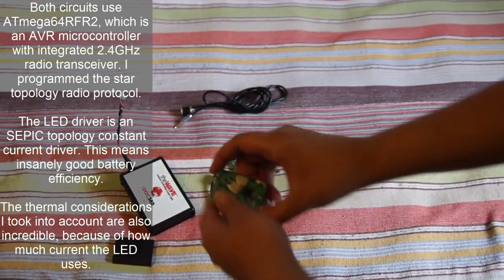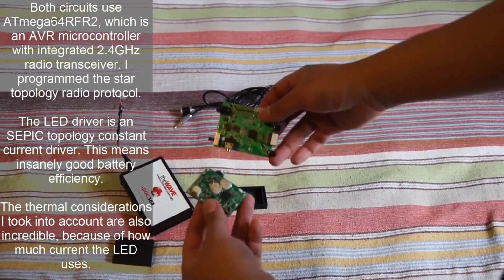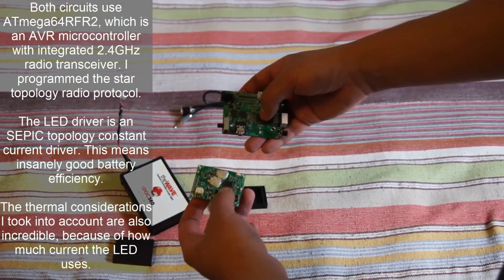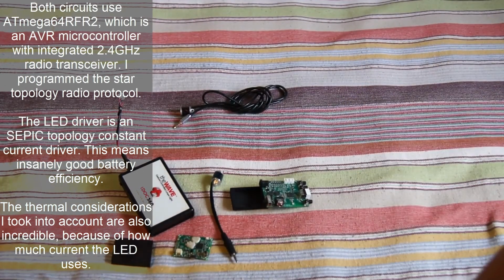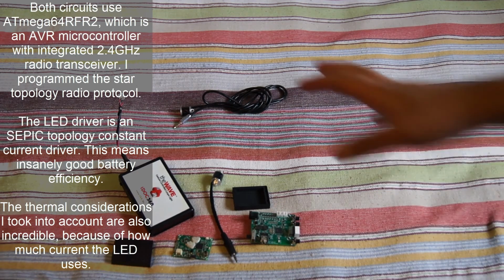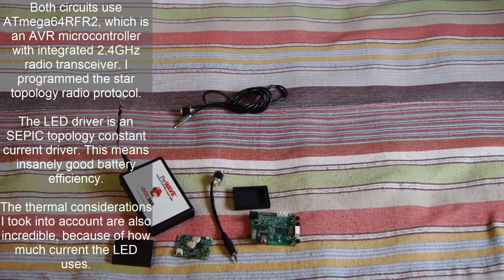And on the circuit, I've used a pretty beefy LED driver, and the microcontroller is the ATmega64RFR2, which is pretty special in the AVR family because they have built-in wireless radios, 2.4 gigahertz. They're like Zigbee radios, and it's a custom protocol that I made, sort of a star topology, so you can have multiple remotes paired to one single unit. So it's a pretty cool chip. If you know what Arduino is, it's basically an Arduino with a built-in radio.